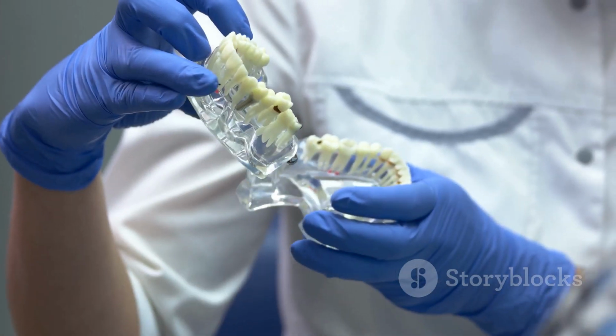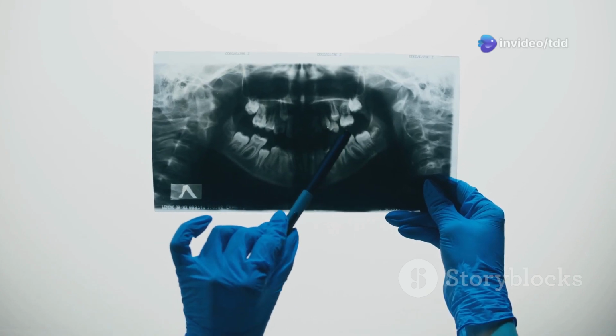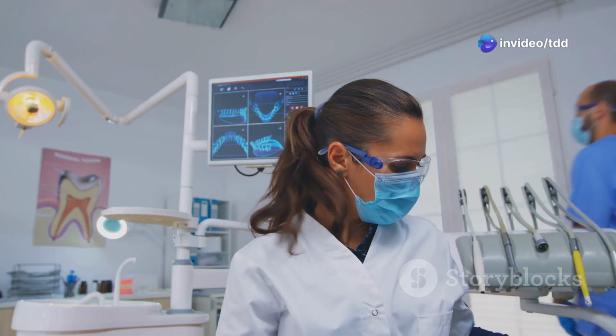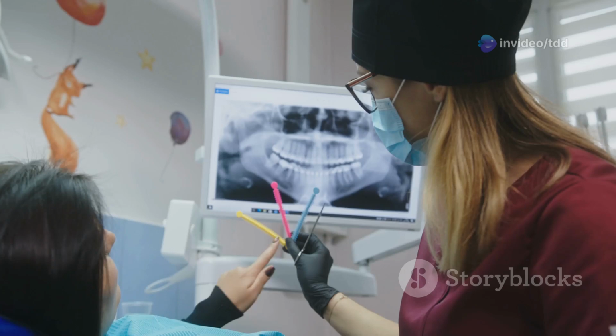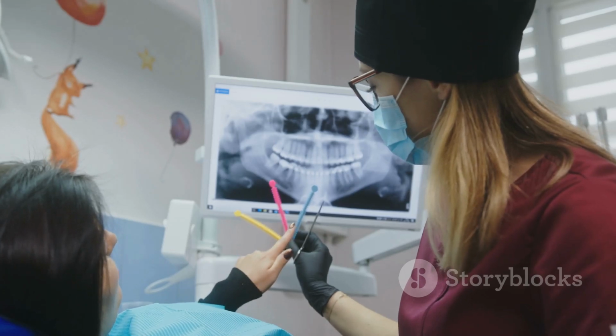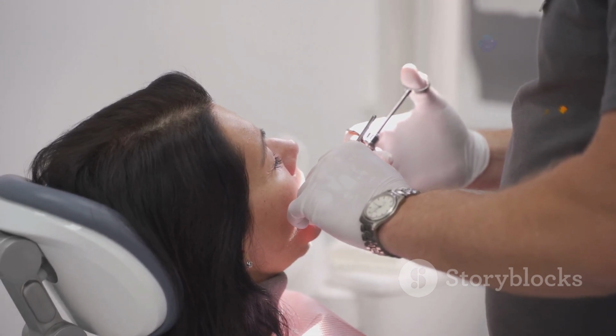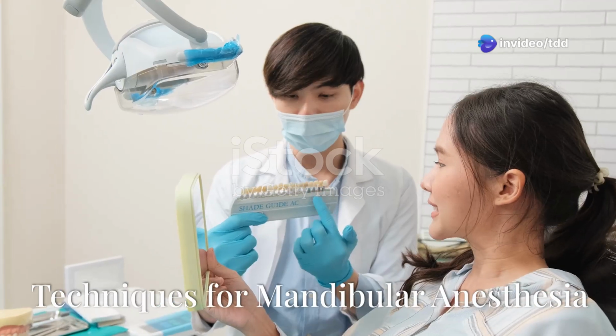The mandible is different from the maxilla because of its thick cortical bone. This makes infiltration anesthesia less effective, so we often rely on nerve blocks. The main nerves to target are the inferior alveolar nerve, the long buccal nerve, and the mental nerve. Let's break down how to locate and anesthetize these effectively.